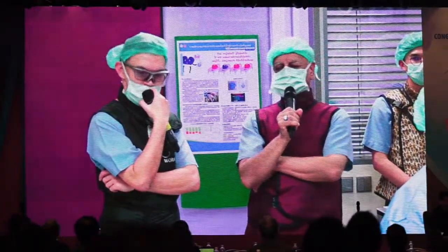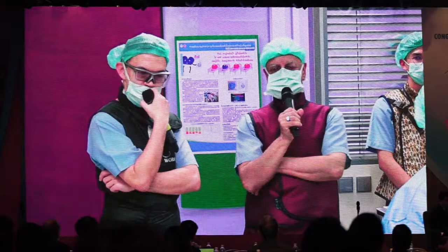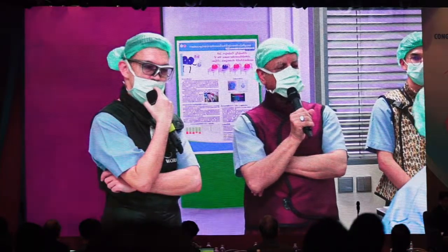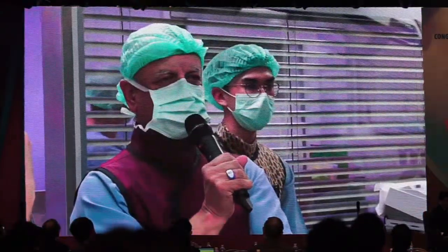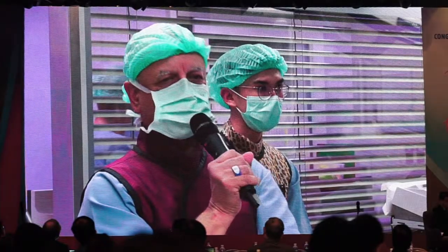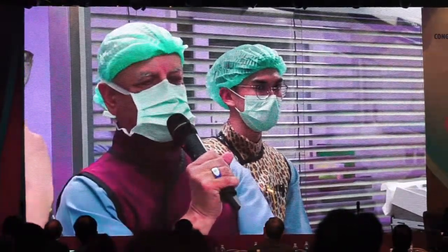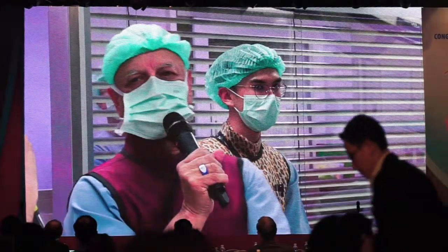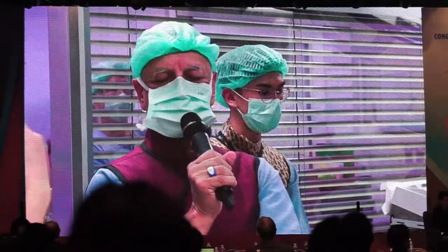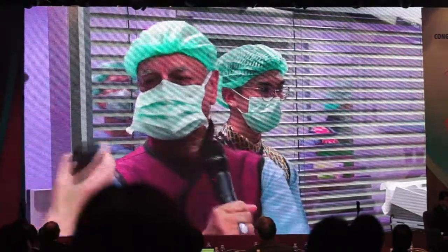So first question for the panel, based on what you've seen on the TOE: to close by catheter or not to close? I would definitely attempt it. Yes, with the sheath across there, I would definitely see what the device looks like before actually closing it. In this particular case, we can attempt to close with a transcatheter device, but I am not 100% sure, because of the inlet extension. The defect is very clearly seen in the four chamber view. Device position may be quite challenging. So what's your concern with the inlet extension? The device embolizing, or the device not configuring well, or what?